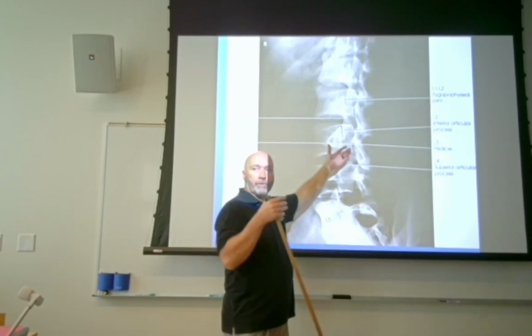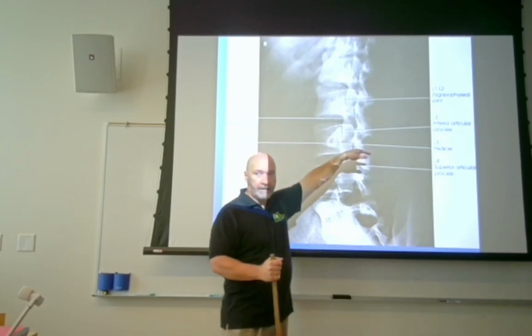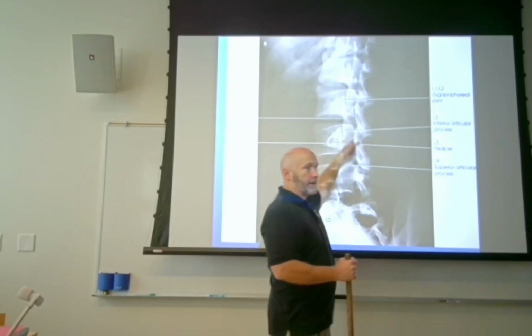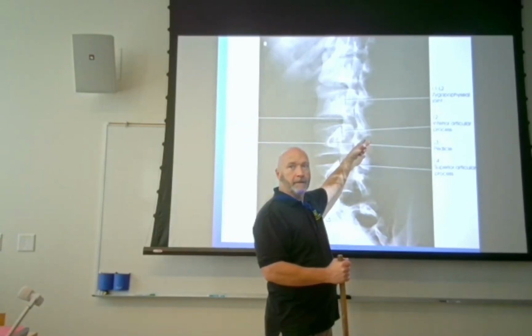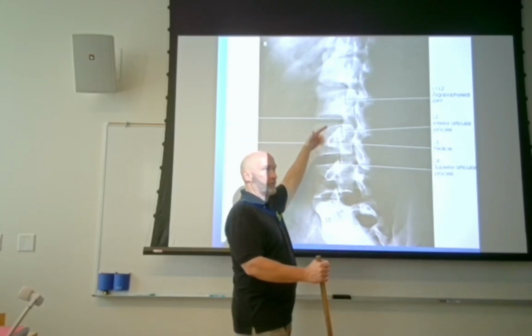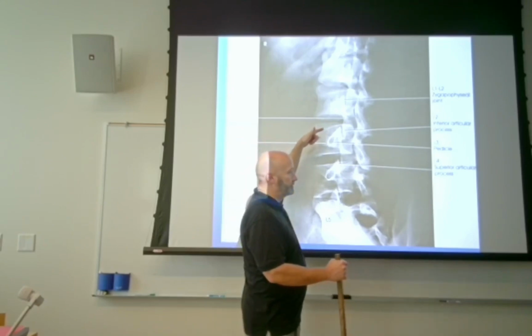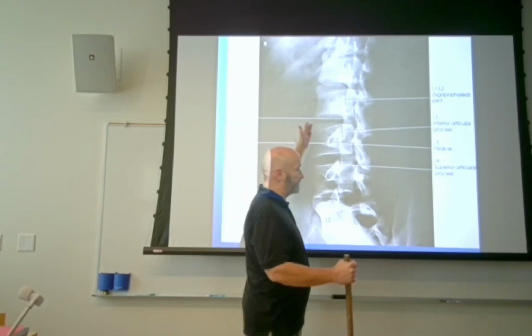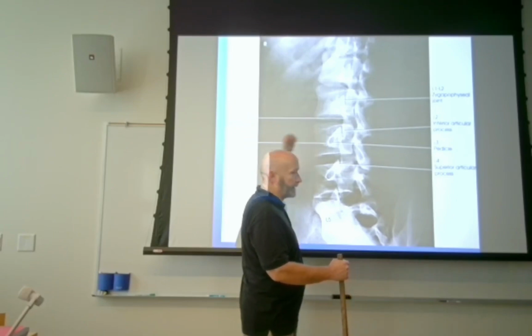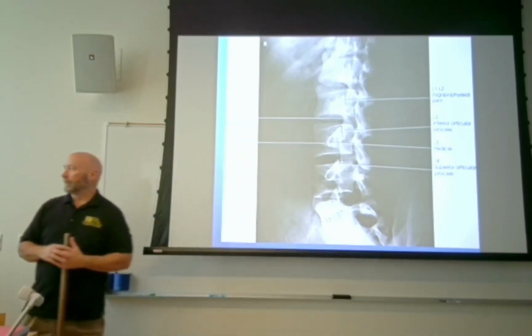The further you rotate the patient up, the more that transverse process is going to go behind the vertebra, because in a perfect lateral, it's going to be right at the back of the body. What you want is, and this is critique next year that we're going to talk about and test on, so it's not on this test, but just in case you see one of these, the tip of the nose should be right at the edge of the body. That's how you determine whether or not you got a good oblique.